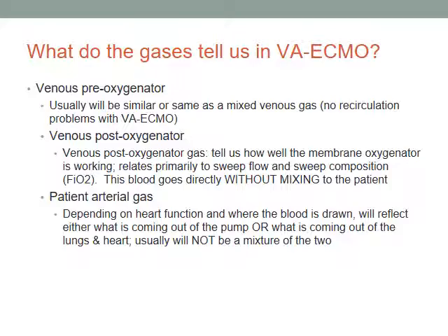So as I said, venous pre-oxygenator is just like a regular mixed venous gas. Post-oxygenator tells us how that's working, and the patient arterial gas tells us all sorts of things about the patient that are often hard to sort out.